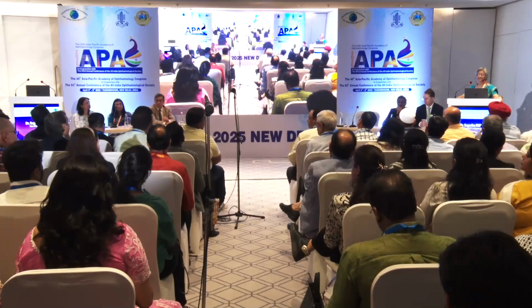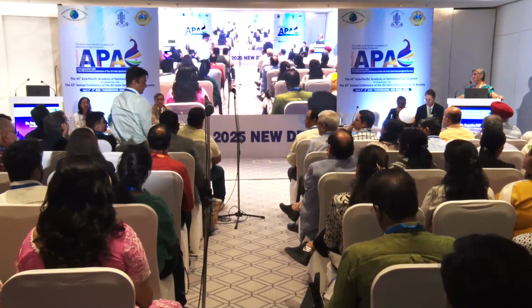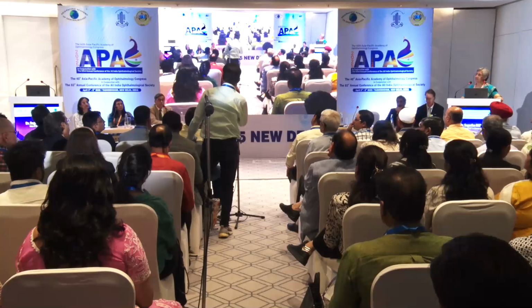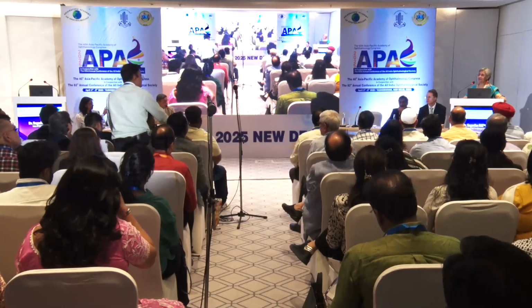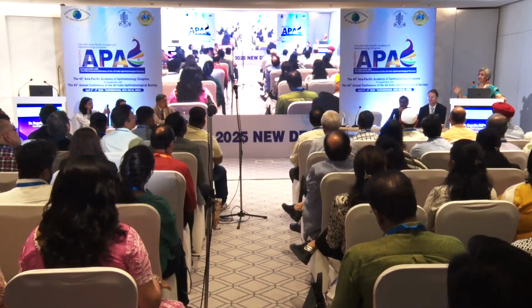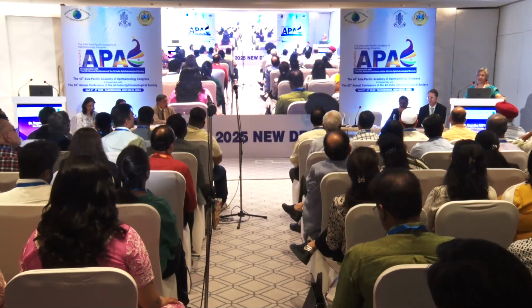Do we have any questions from anyone in the audience? What about AS-OCT in glaucoma? Yeah, we have AS-OCT, but sir, I would definitely place my bet on gonioscopy, a proper good gonioscopy done in the correct method, with a dark room, etc., before I would place my bet on an AS-OCT.